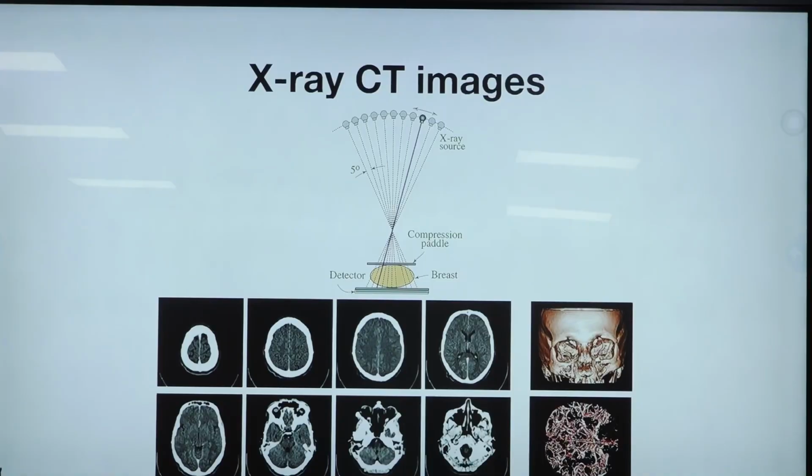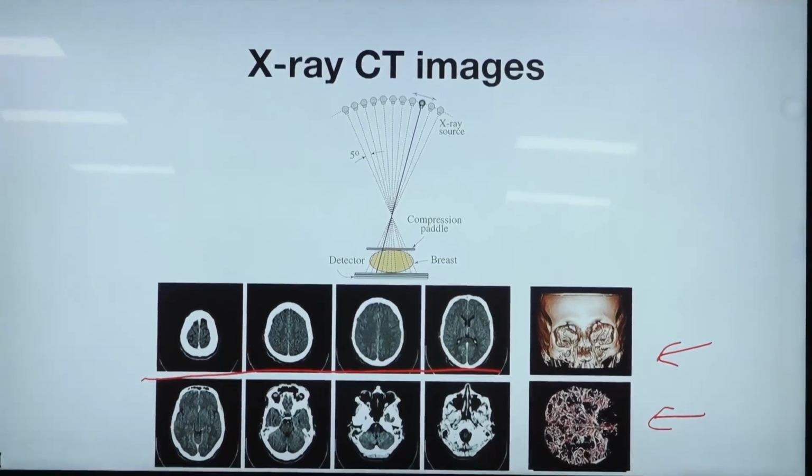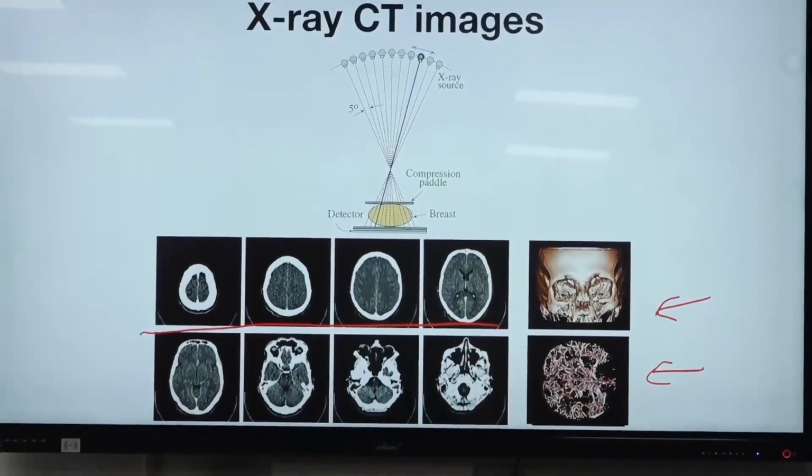These are the different sections you can measure. You can do a 3D reconstruction, for example of an entire head, and figure out the shape of the skull or the shape of the head. There are different object properties you can measure. For a living person, you can get a three-dimensional reconstruction of the inside of the head, the skull and how it is, and so on.